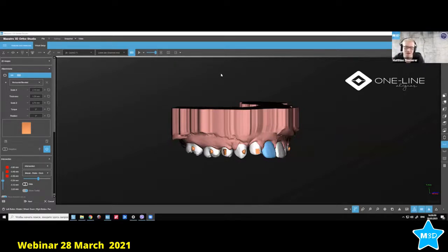And how can a software handle this? I also think for some basic movements, yes. For example, if I will be making my software like in Maestro, if I will work with Andrea, right? So I will tell him, if you have a surface area, let's say in square centimeters, right? So when you have a buccal surface area with minimum, let's say 7 square centimeters or 6 square centimeters, then we don't need an attachment, for example, right?